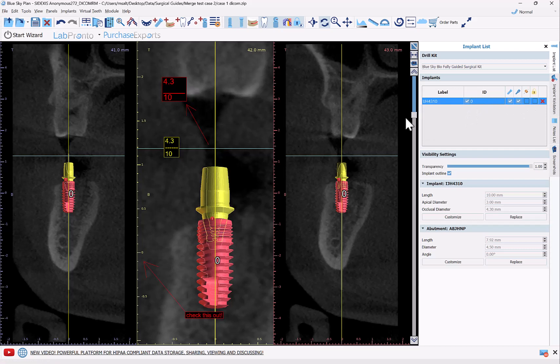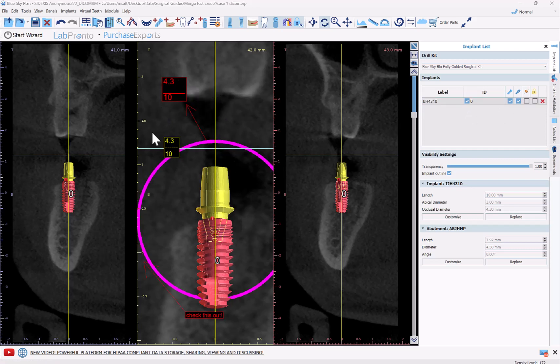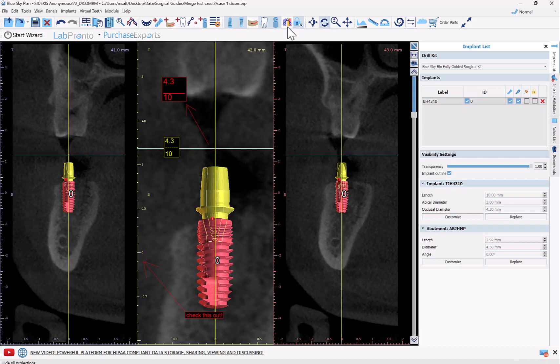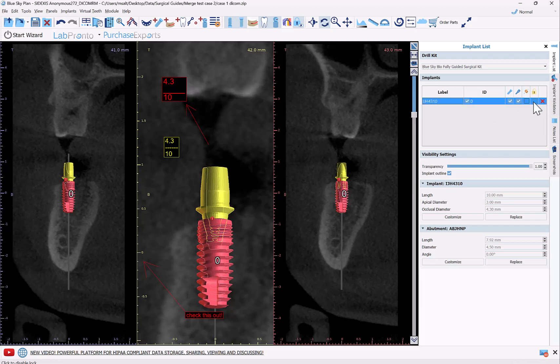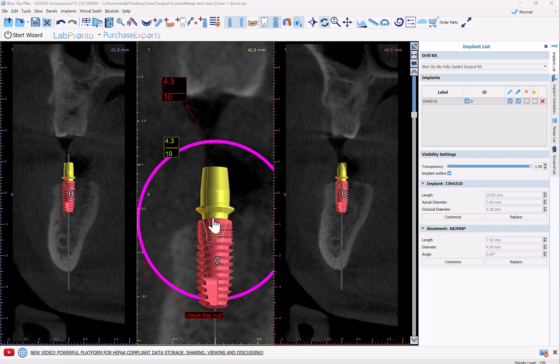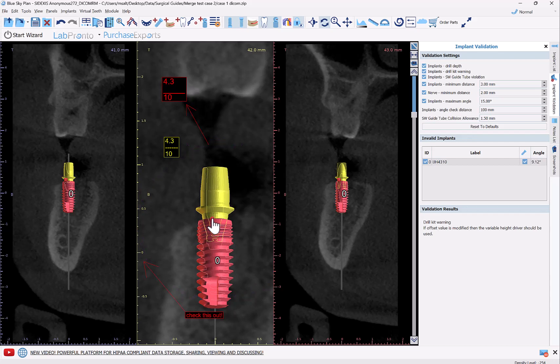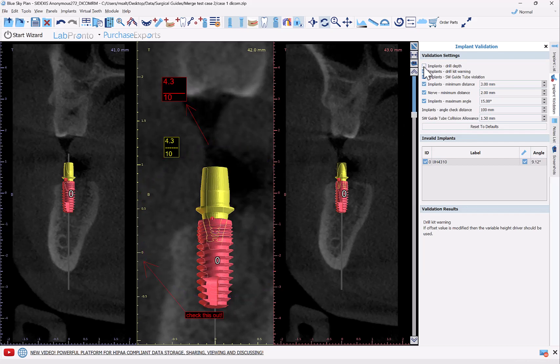You can toggle on and off the visibility of the implant number. If you want to clean up the image and get rid of the cross lines, simply turn off the lines using the button here. If the implant is locked — showing the lock symbol — you can unlock it to get rid of the symbol. If you have violation warnings showing exclamation marks, you can click on them to hide the warnings.